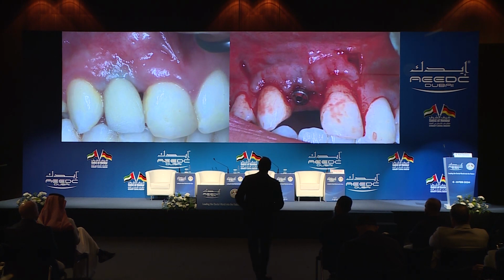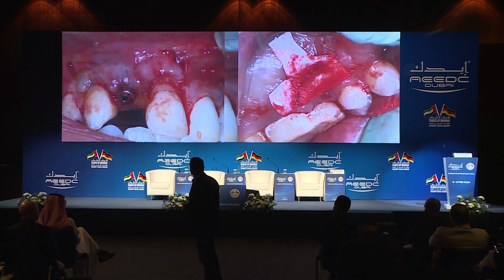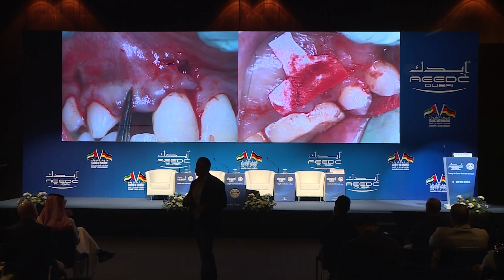And this is what we did. I placed the healing abutment, not the cover screw this time, because I wanted to try to hike the tissue to a higher position. And I took a customized connective tissue graft.